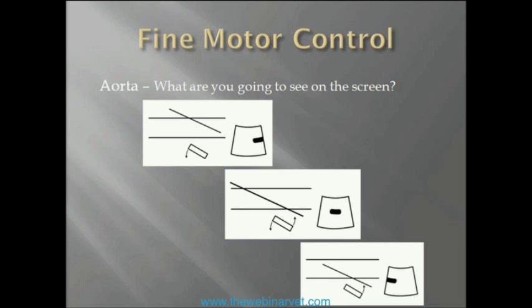If you're not quite aligned on the aorta, you might get the back of the aorta on the right-hand side of the screen but lose it on the left. What you need to do then is hold the back of the probe still and move the front of the probe onto the aorta, so you end up with that straight line right across the screen.